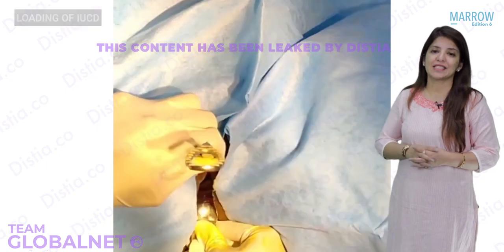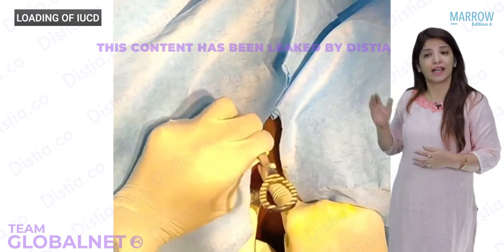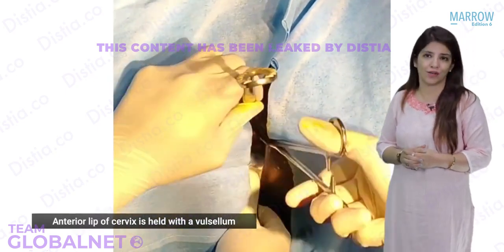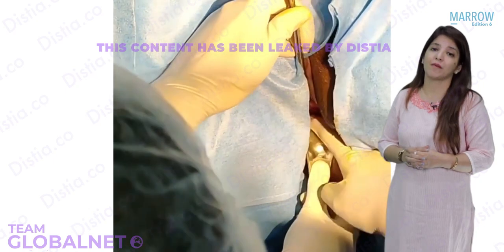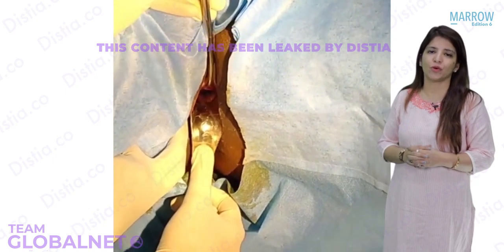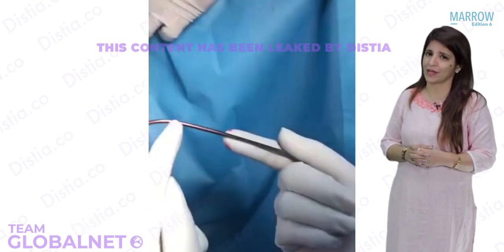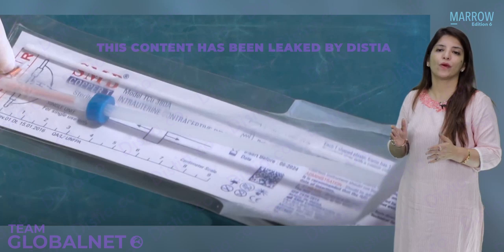Now, in this video, you can see that a Sims speculum has been placed so that the posterior wall is retracted. The anterior vaginal wall retractor has been placed so that the anterior vaginal wall is retracted. And now I am using a vulsellum to hold the anterior lip of the cervix. Once this is done, I'm going to take a uterine sound and measure the length of the uterine cavity. So now you're going to see that we measure the length of the uterine cavity with the help of a uterine sound. Once I have measured it, I am going to tell the approximate length to my assistant. Now my assistant is going to load the copper T.